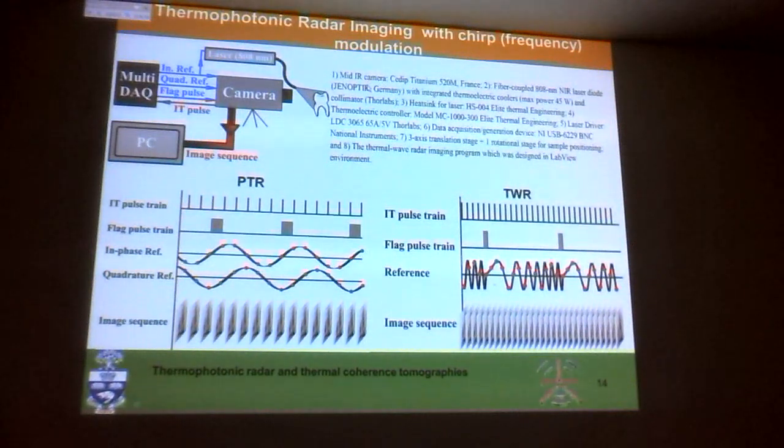How do you do that physically? You have an infrared camera. One of our first approaches is in dentistry, because dental samples are just right. Your teeth have enamel that's quite thin, and then there is dentin, and then you go to the pulp. So these distances of the order of a few hundred microns to a millimeter or so are just right for thermal wave fields. So one of the first applications is in dentistry. In fact, we have made this application. Now we have a company that sells dental detectors. But for the camera, we don't have that yet. It's just single point measurements.